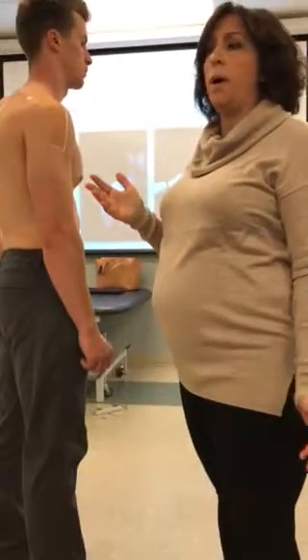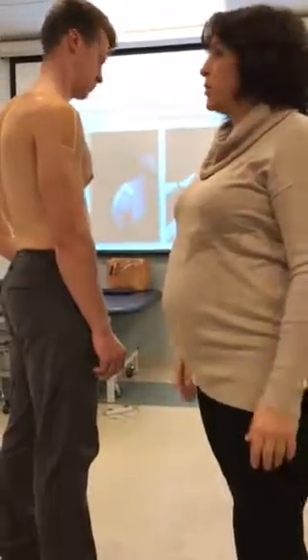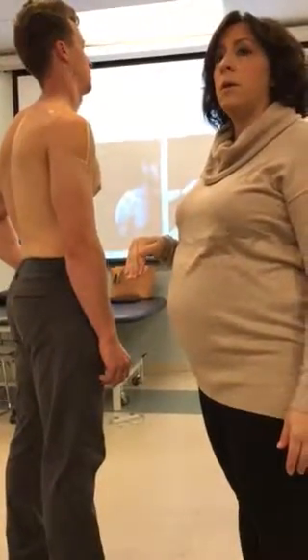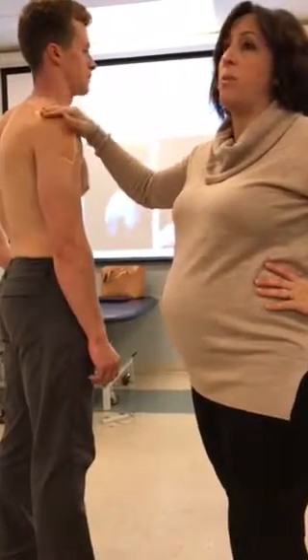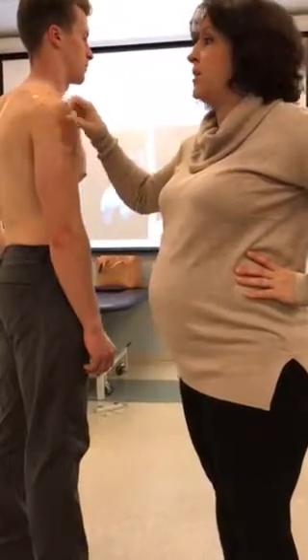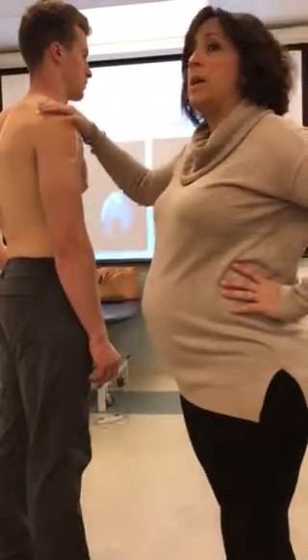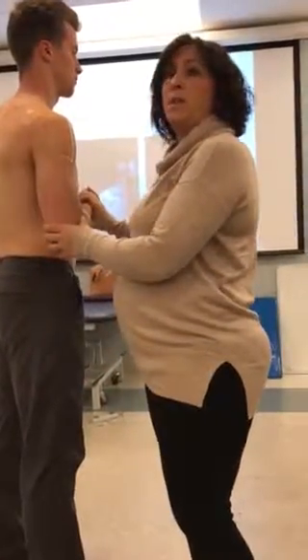Very, very simple joint to tape, because there's not too much you really can do. You just have to think about compressing and stabilizing it. And then after you did this to your athlete, especially if there's a step deformity, most athletes with an AC sprain are not going back in. It's too painful. They take one more hit here, it's just going to be so painful for them. So they're most likely out. But you'll do this. You will stabilize them, and you'll sling them if you need a sling.